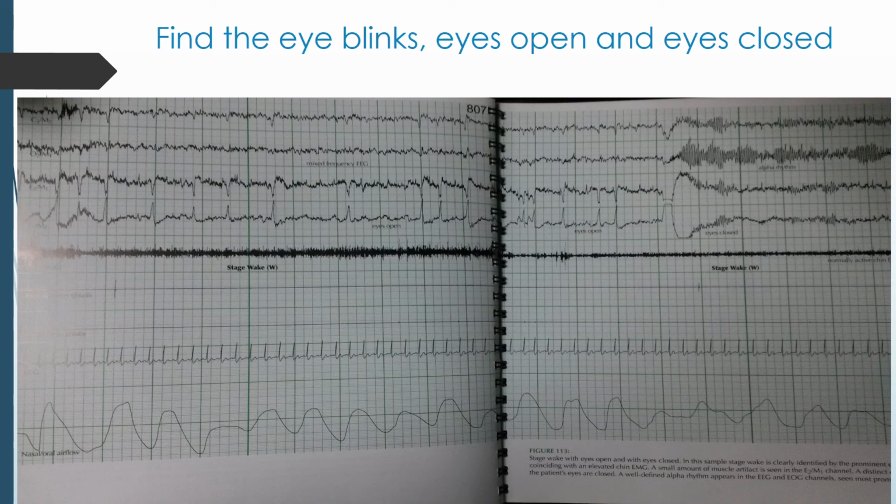So if you look from left to right and eventually you see where the patient closes their eyes, look how different that alpha rhythm is. So that is how their brain activity and their eye activity changes as soon as they close their eyes, because muscles are relaxing in their face, and so that alpha rhythm is attenuated or accentuated.